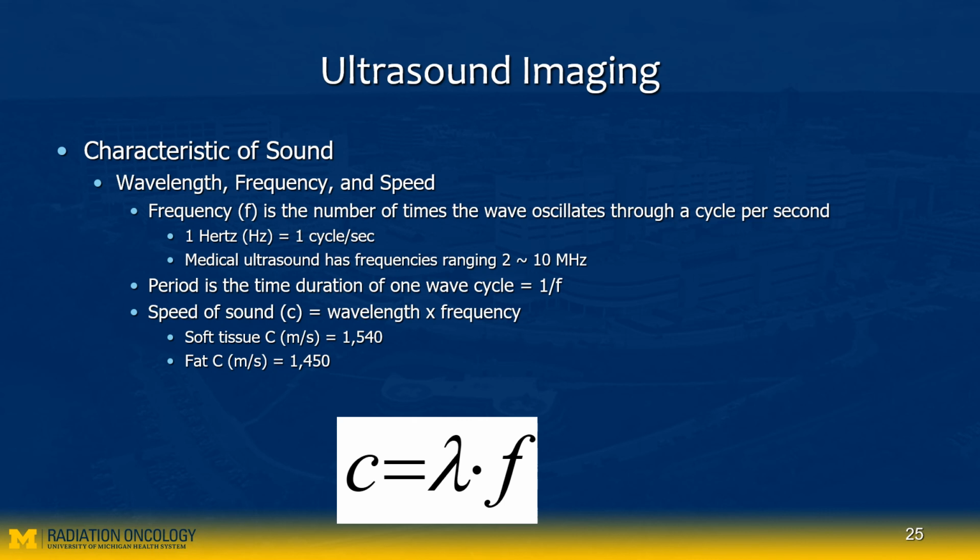Medical ultrasound typically has a frequency of 2 to 10 megahertz, which means in one second you have 2 to 10 million cycles.